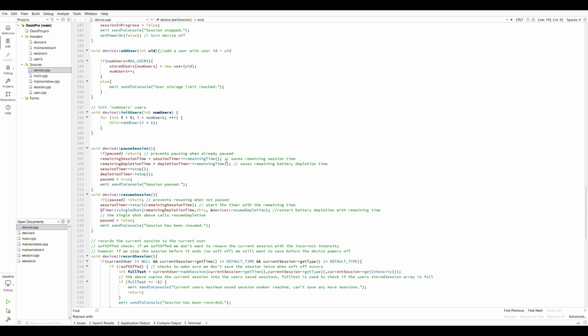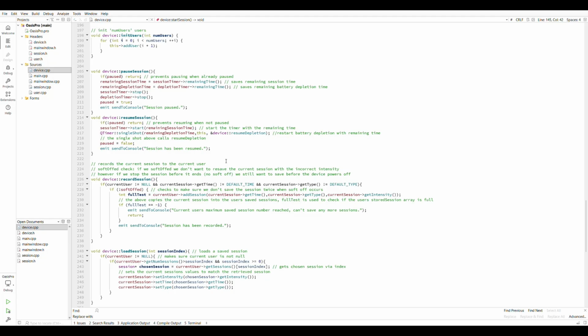There's definitely a lot more to it, a lot more edge cases which get covered by the software. You could check out this code along with the documentation file I have in the repo if you want to get a better idea of the whole program structure. There's a UML diagram in there which will show you all the classes and their variables and functions. You can also go and look at the sequence diagrams or the activity diagrams to get a better idea of the program control flow.